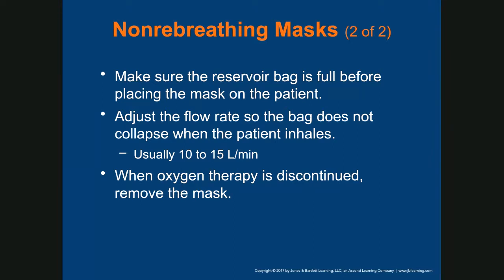When oxygen therapy is discontinued, remove the mask. Make sure to remember that part. If you have a non-rebreather on a patient, do not turn off the oxygen with the mask on the patient. Take the mask off first, then turn off the oxygen.